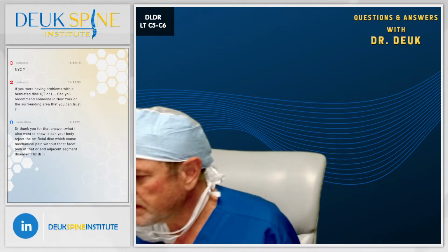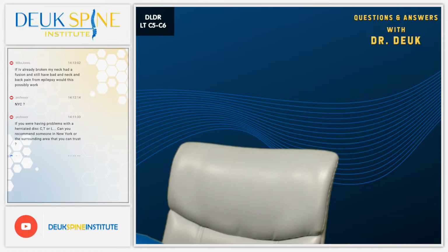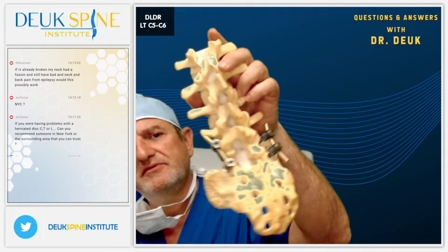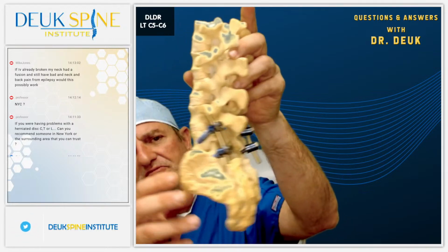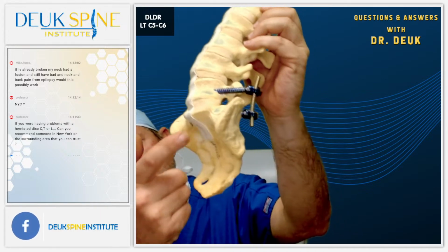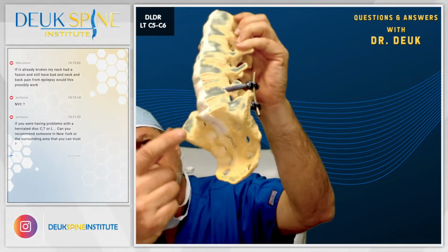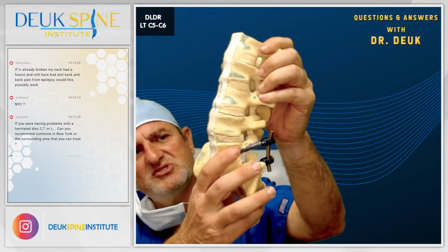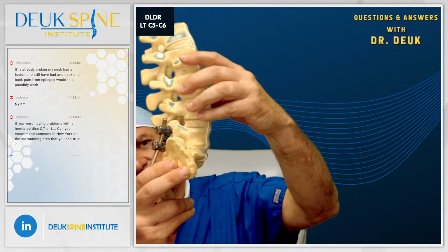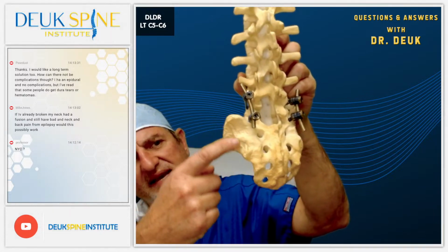Yes. So I'm grabbing a fusion model. Let's take this one right here. We've got a back. This person had screws put in. They're getting an instrumentation and fusion at L5-S1. L5 is the bottom bone in the spine. S1 is the first bone in the tailbone, really 5 bones fused together, so S1 is the top. With an L5-S1 fusion, adjacent segment disease is where you get symptoms that develop at the next disc above, L4-5, or the facets above, L4-5, or below at the SI joints.